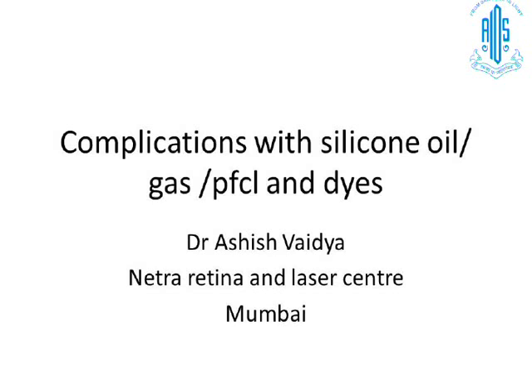In the next 7 minutes, we are going to see what the intraoperative problems are which happen with silicone oil or gas. Mind you, there are not too many intraoperative problems directly related to the oil or gas, as long as you have relieved the traction, the way Bhushan has said, before the surgery.